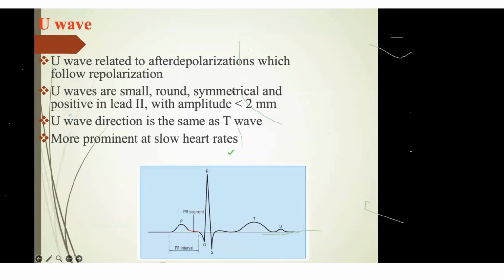Okay. Another question is the significance of hyperacute T wave. Hyperacute T waves indicate there is ongoing myocardial ischemia, because subendocardial ischemia sets in, and it can always go to ST elevation MI in the immediate period. Hyperacute T waves are usually seen in anterior MI, and can also be seen in inferior MI.